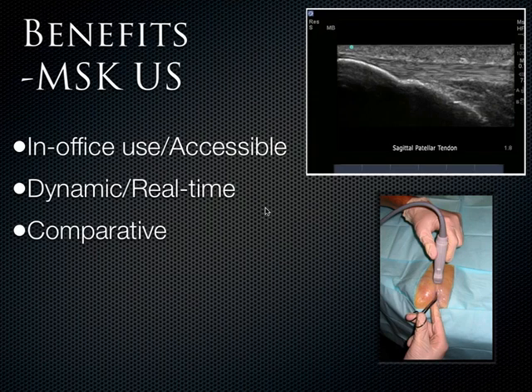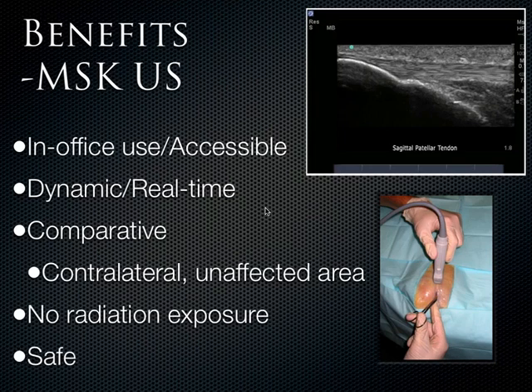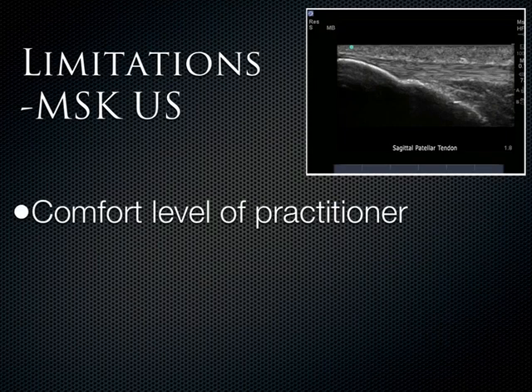In particular with musculoskeletal, sometimes there's a bit of a learning curve here, but you always have the other side to compare to when you're worried about something pathologic. So if you're not sure whether you see a tendon tear, or it's a partial tendon tear, go look at the other side, assuming the patient hasn't had an amputation, and you should be able to compare it. And that's really helpful. Of course, there's no radiation exposure, and it's safe.